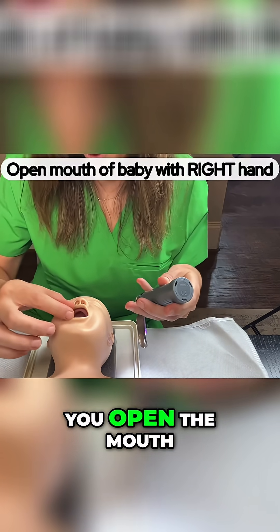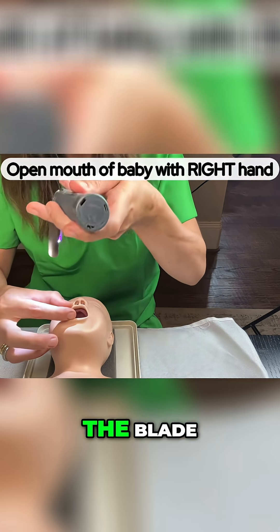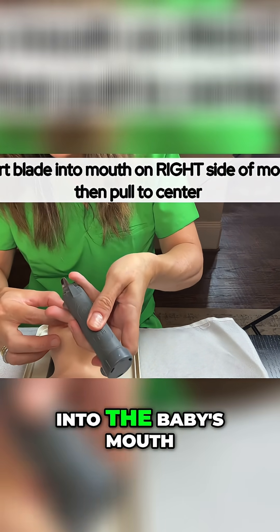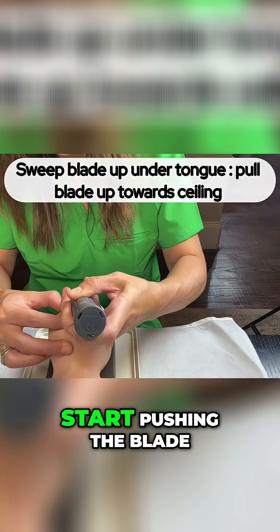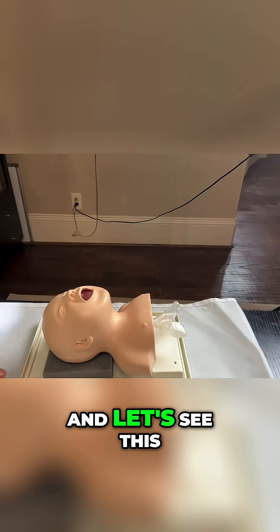The first thing you do is open the mouth of the baby with your right hand, then put the blade starting on the right side of the mouth into the baby's mouth. Then sweep up under the tongue and start pushing the blade up towards the ceiling.